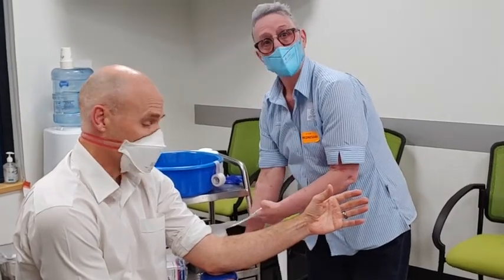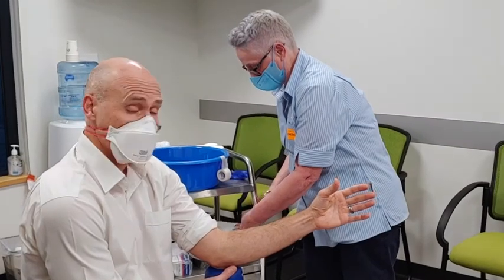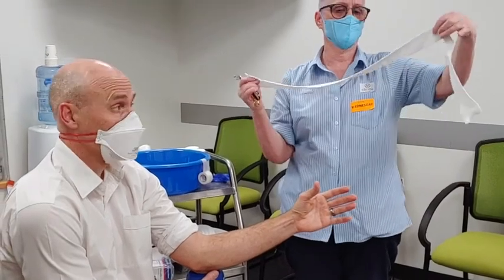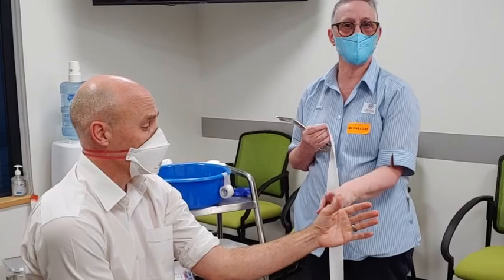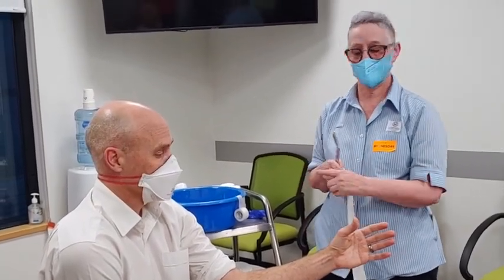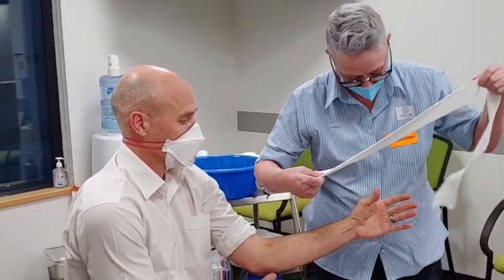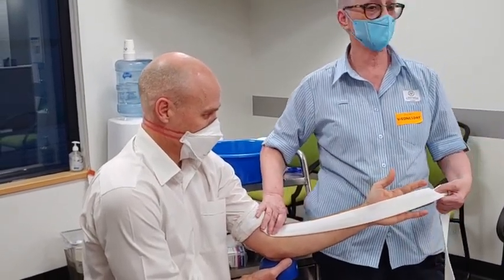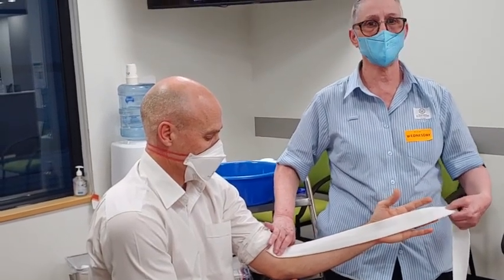This is a two inch. From paediatrics to adults, you'd still go with a two inch for a child because it's not really very wide. Over the thumb, if you were doing a scaphoid, it would always be a one. We measure just past the crease of the elbow to just towards the fingertips — you need a little bit more than what you want. Over-measurement is better than short.